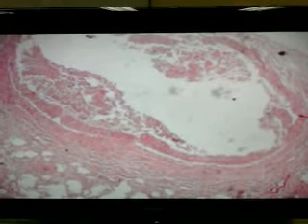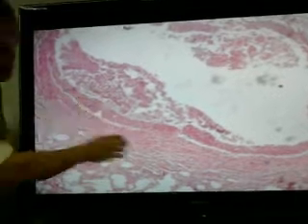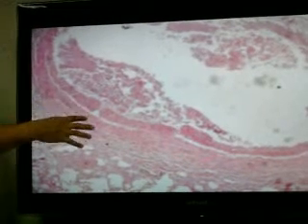For the three slides, you'll be looking at similar areas which are more or less necrotic debris. So this is not a peptic ulcer. Okay, so I'll show you this. This is not a peptic ulcer. Why? This should be your clue that this is not gastric ulceration. This may appear like an ulcer, but it's not an ulcer. This is an abscess.